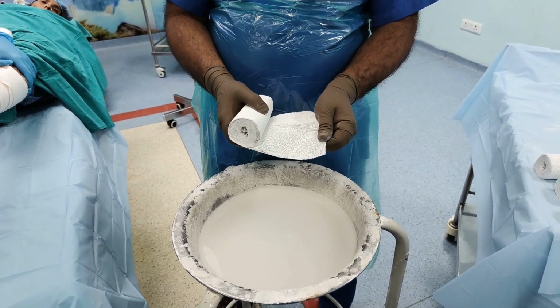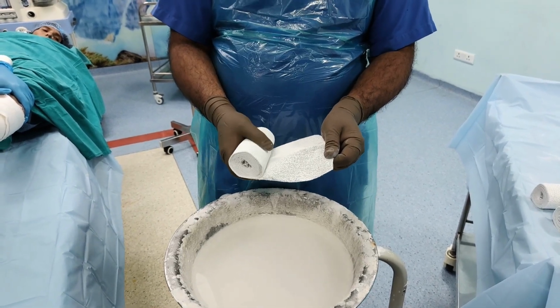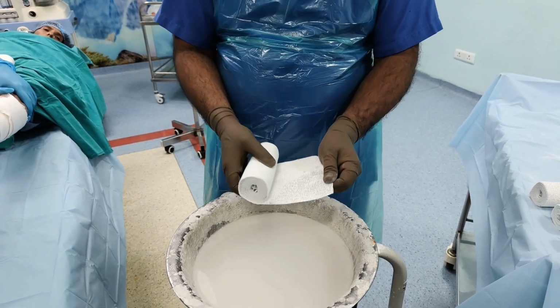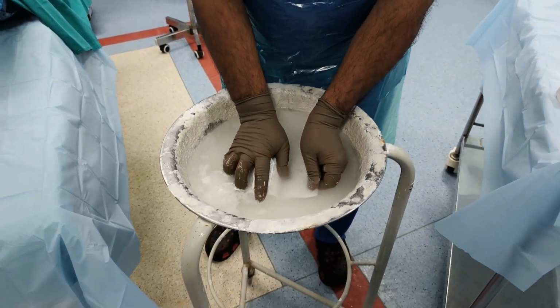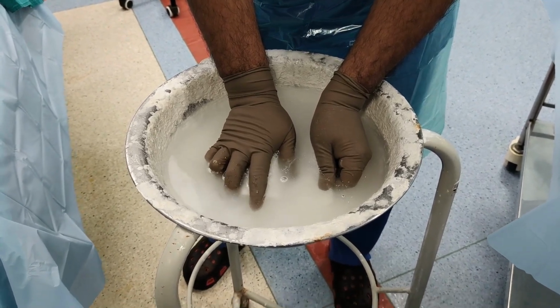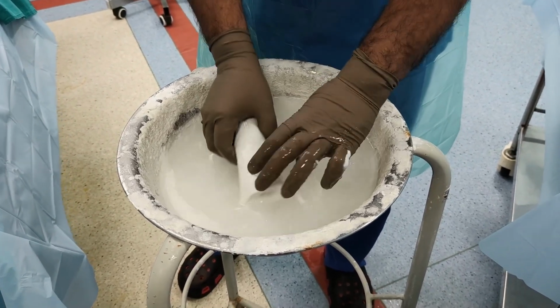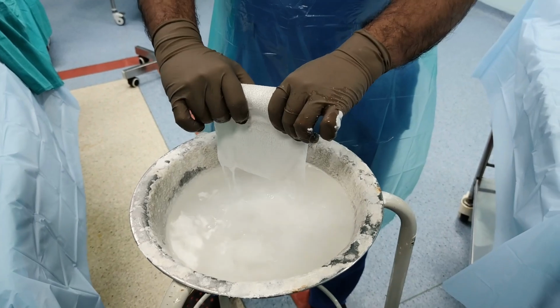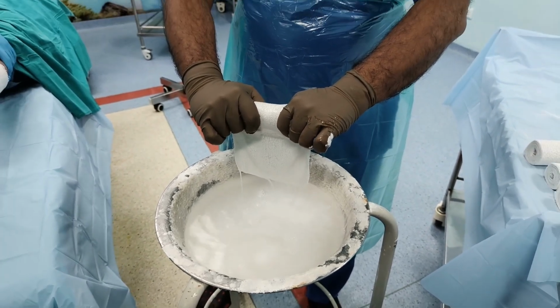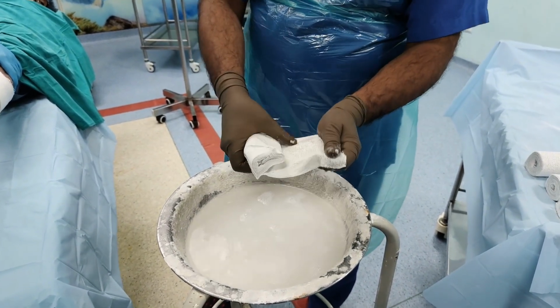Always hold the edge of the POP bandage with your left hand and the roll with your right hand. Then soak it in water, and keep it in water till the bubbles stop coming out. Once the bubbles have stopped, take it out and squeeze the ends of the plaster. Then again hold on to the edge of the plaster and move to the limb.